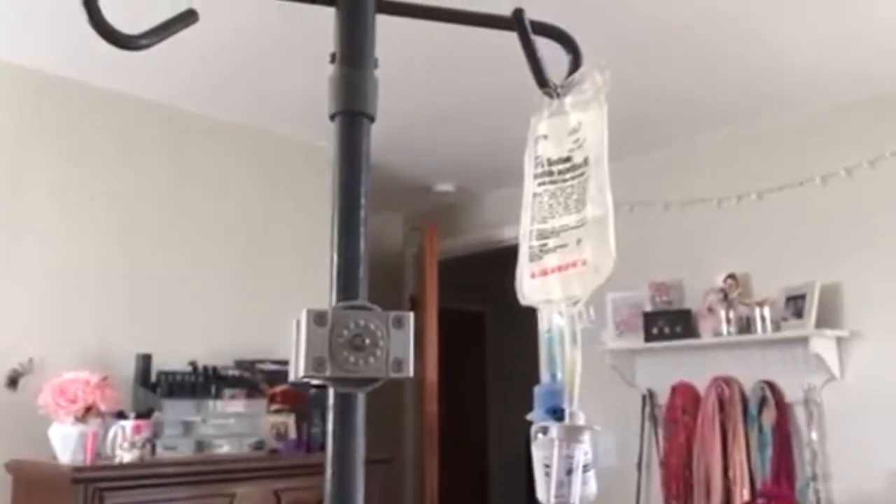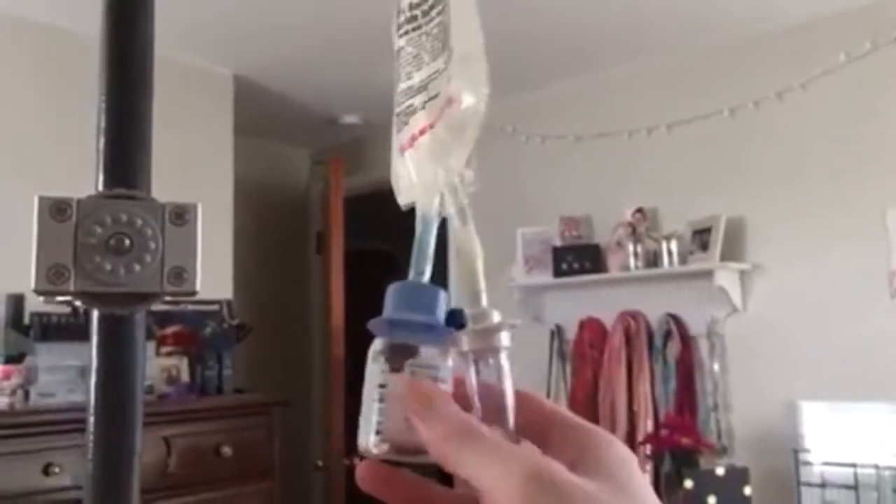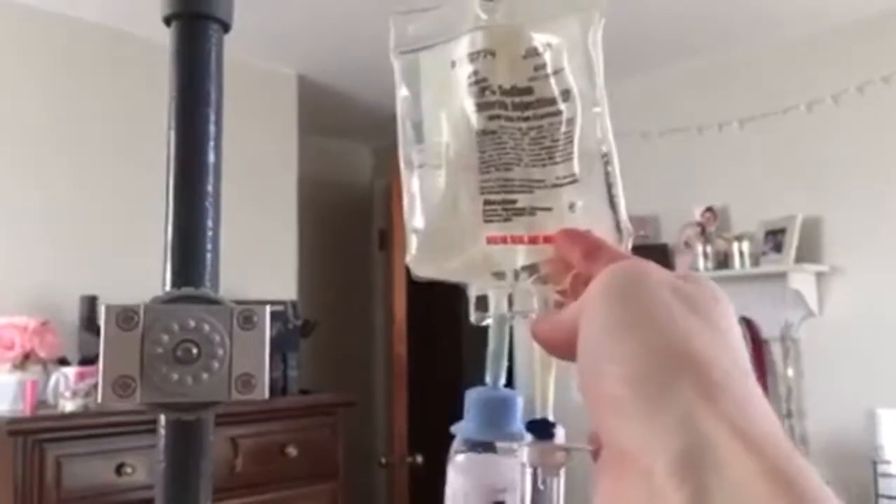It was like a big wide syringe full of yellow medication, and you just hook it up and slowly push it over five minutes. Now I have this right here — the bag where the powder comes in this little container, and then it's just a hundred milliliter bag.